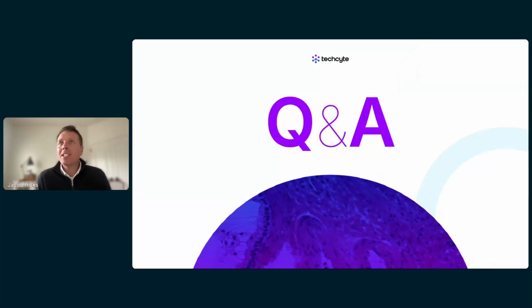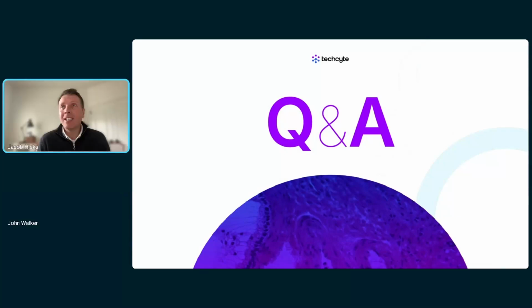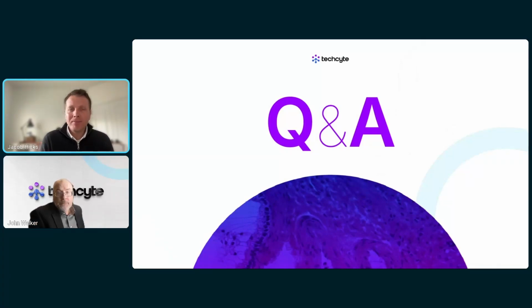Next question was, is this viewer IMS integrated to Epic Beaker? And is the case synchronization bidirectional? Meaning, are the cases in sync whether you're working in Beaker or Techcyte? John, let me have you take that one. I'll say that we do have an open API, so we can integrate with any LIS, including Epic Beaker. We do have a bidirectional potential. John, anything you'd add on this question? You pretty much covered it there, Jacob. It's a standard web REST interface to integrate with.